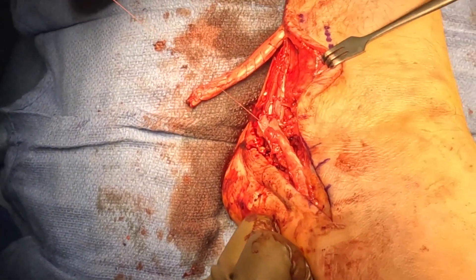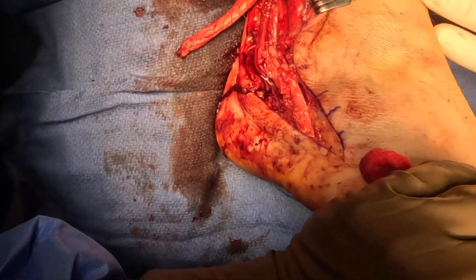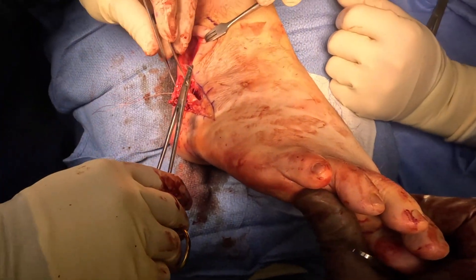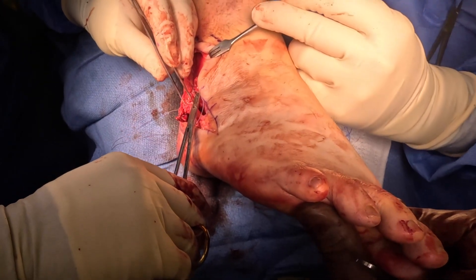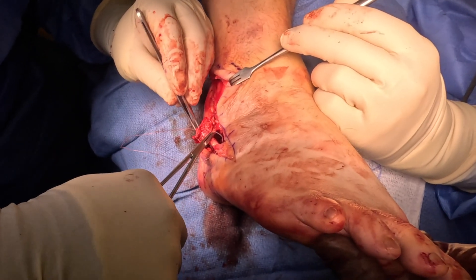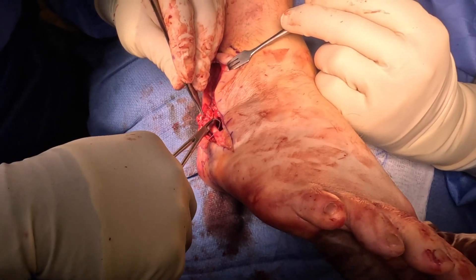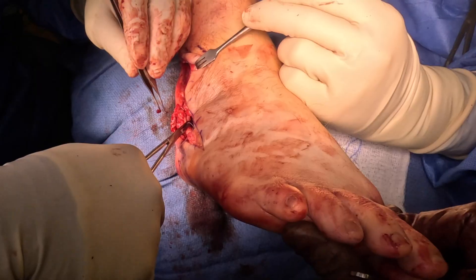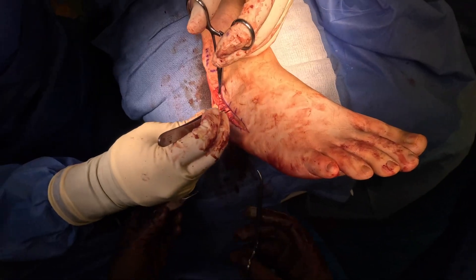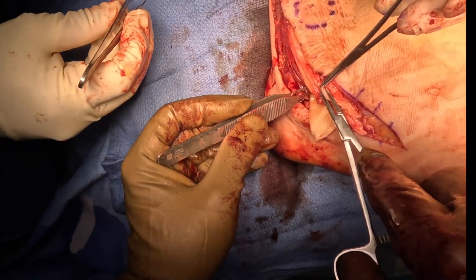You can see we took the distal-most stump of the brevis and we're attaching it to the fibers from the proximal end of the brevis tendon — sewing those two ends together as best we can. Then we're going to anastomose or connect the longus tendon to the brevis tendon. Essentially, we're taking two ruptured tendons, putting them together, and creating one large, stronger tendon. This is called a tenodesis or an anastomosis of two tendons, and the goal is to make them one strong tendon.